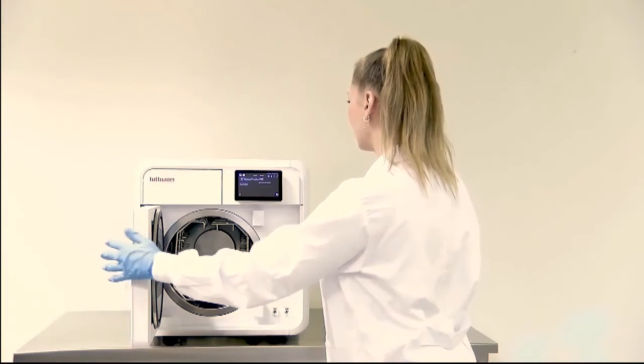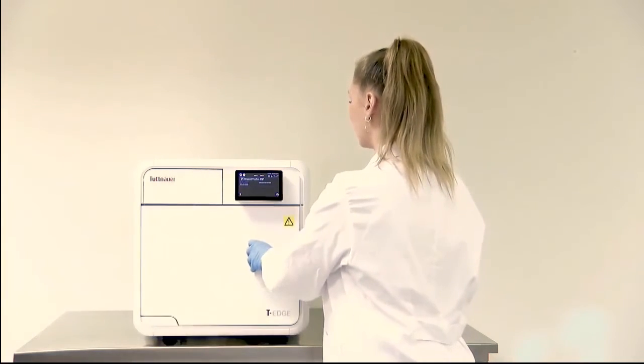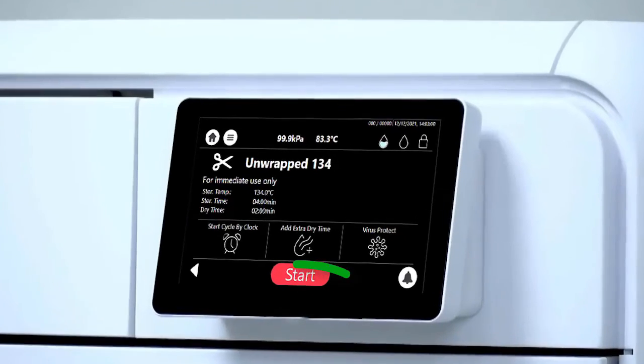After equipment loading, select your required program. Close the door and press the start button.